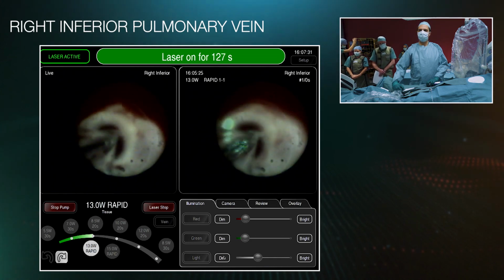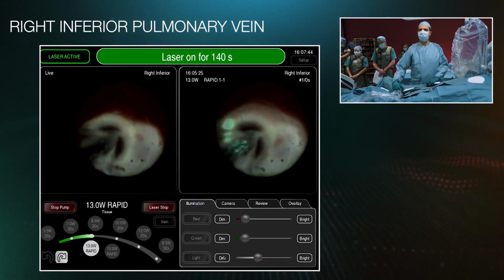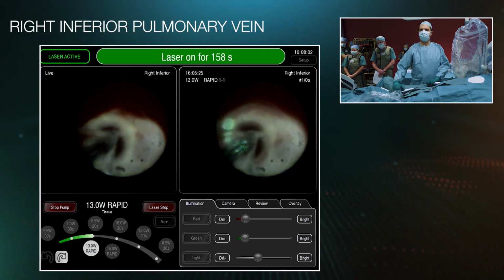And here again, because it's visually quite obvious, I chose to go behind the blind spot. Probably not recommended in early experience if you're not fully confident yet, or if you're not fully acquainted with how a typical laser procedure should go. It's probably not recommended to do this in the first batch of procedures you do, but once you have a stable workflow, it's entirely feasible. There we go. We're behind the blind spot.